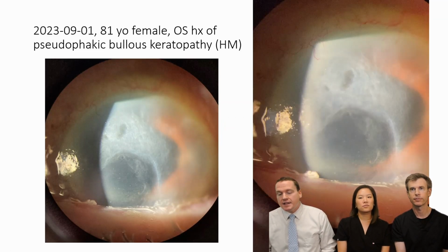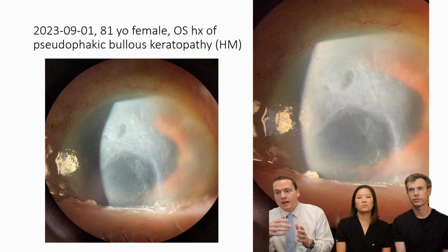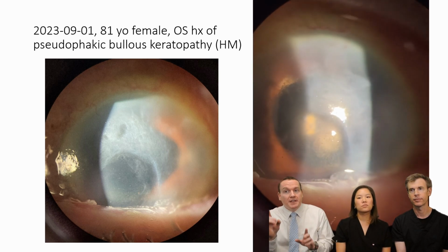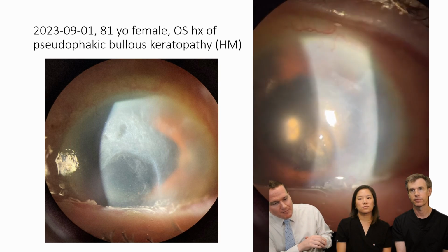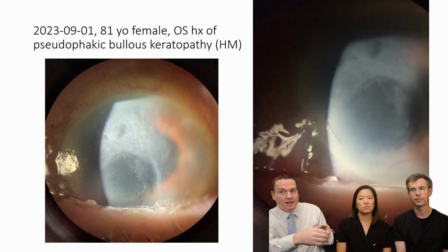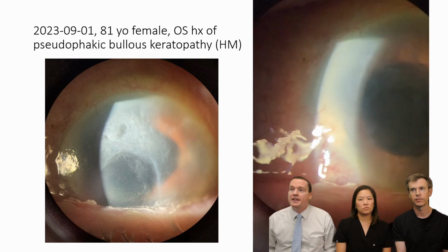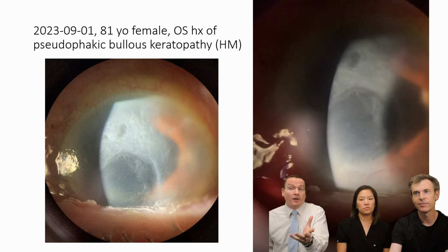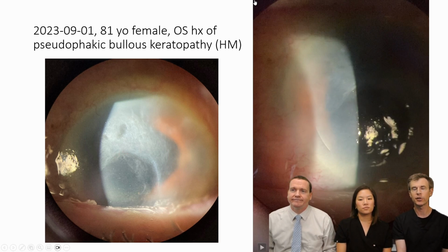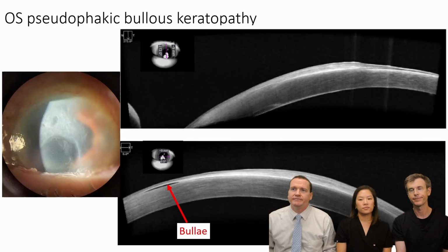And a lot of things can cause corneal problems, in addition to Fuchs dystrophy. You can have pseudophakic bullous keratopathy as an example. This, I imagine, gets a little more challenging in the operating room because now I feel like I'm seeing quite a bit of thickening and roughening of the anterior epithelium. And that needs to be removed as part of the surgery. All of this is additional scarring that chronic bullous keratopathy causes, and yes, that would be an anterior keratectomy that's done at the time of surgery.